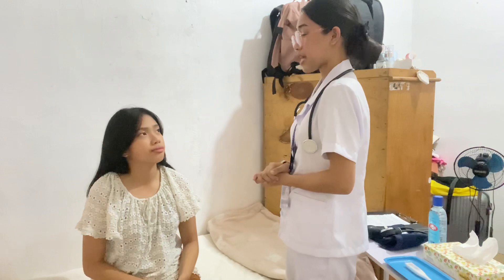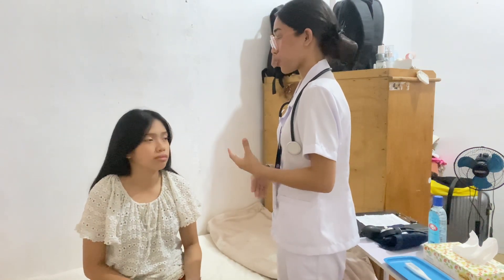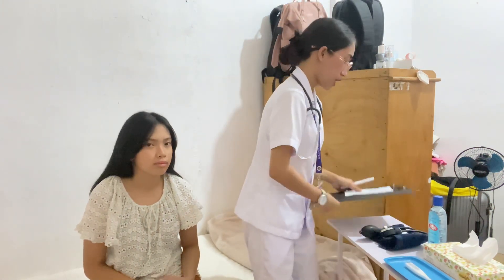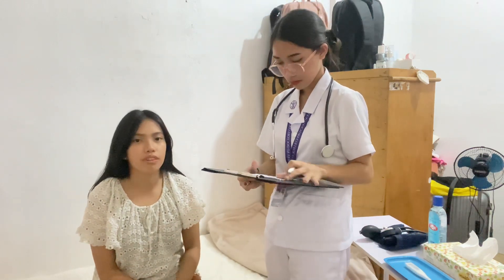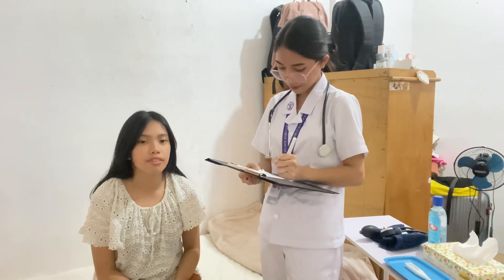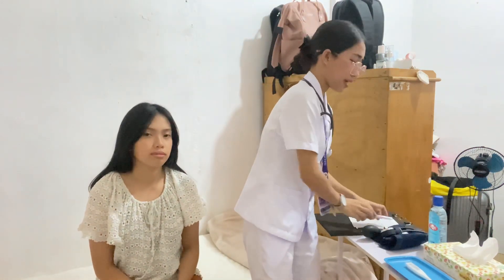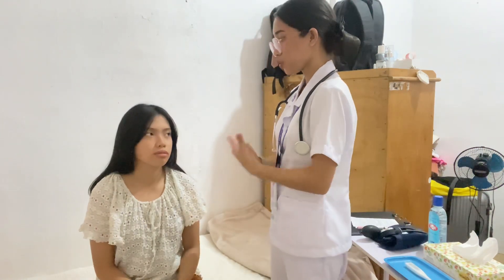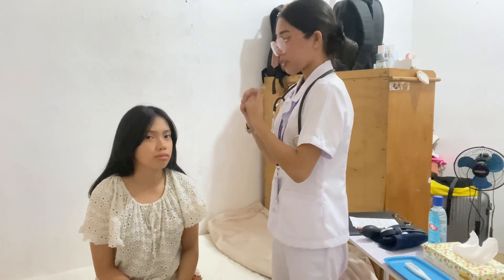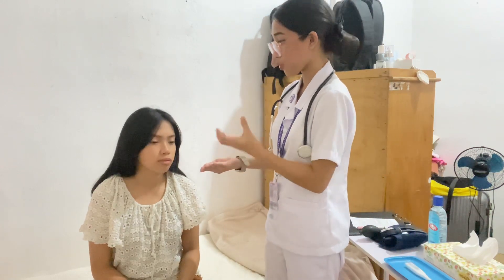Hi ma'am, my name is Pia Gweny Cole-Roculis and today I am going to get your temperature in your mouth — that is called an oral temperature or oral method. Can you state your name? My name is Jed Victoria-Olivar. Your age? 14 years old. Your date of birth? February 27th. Okay, thank you very much ma'am. So now what I want you to do is just follow along so that the procedure will be easy. I'll just put the digital thermometer on your mouth and you just hold it.